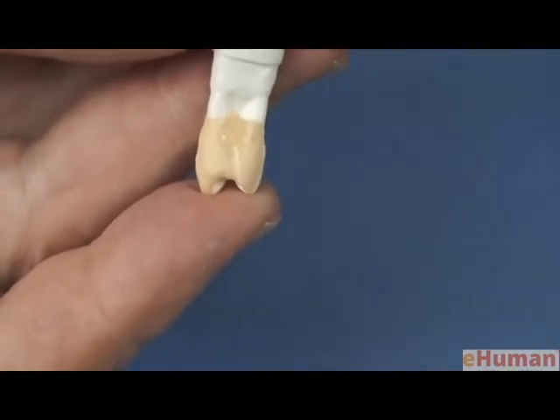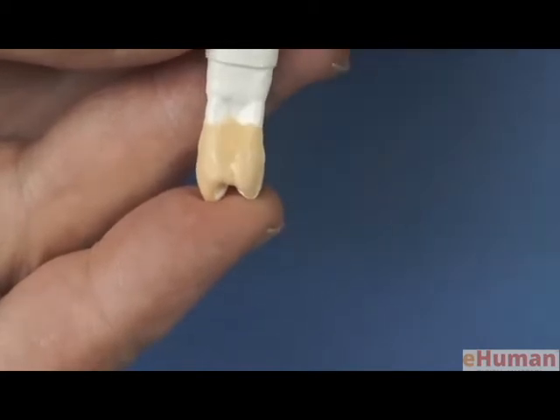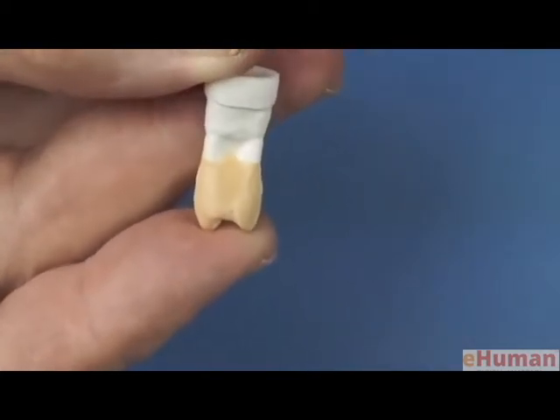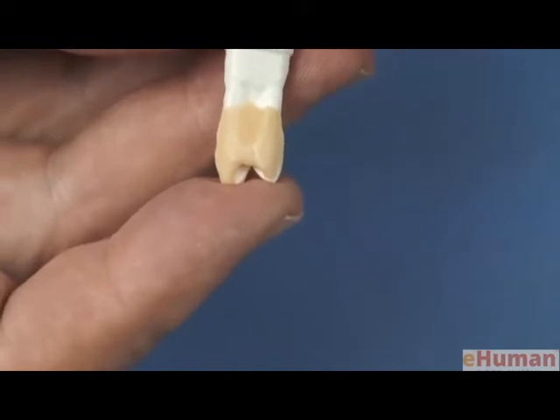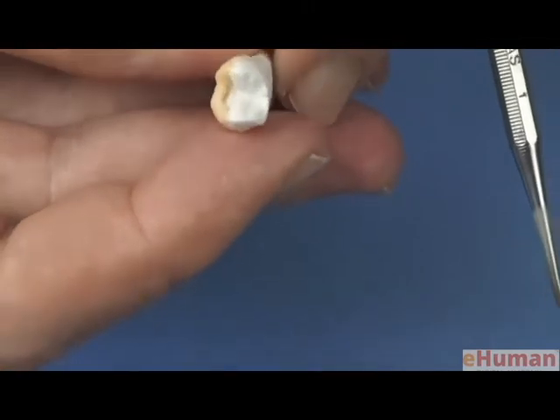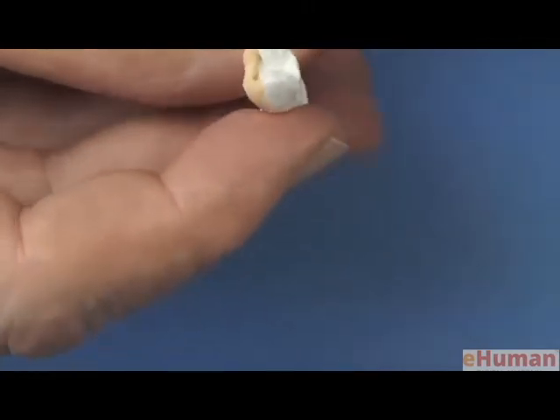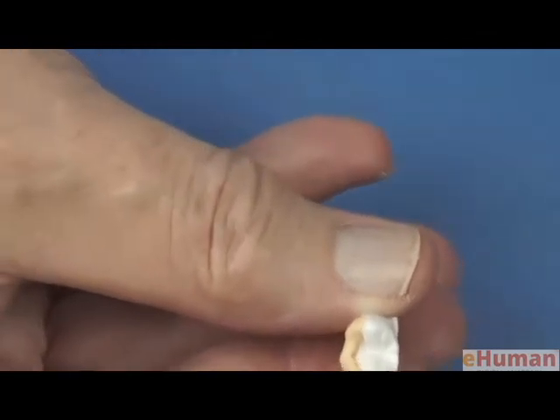So I'm making sure that there's a little bit extra so I can carve the concavity, get the wax nice and smooth. Then we go to the occlusal surface and we'll fill in that area of the tooth.